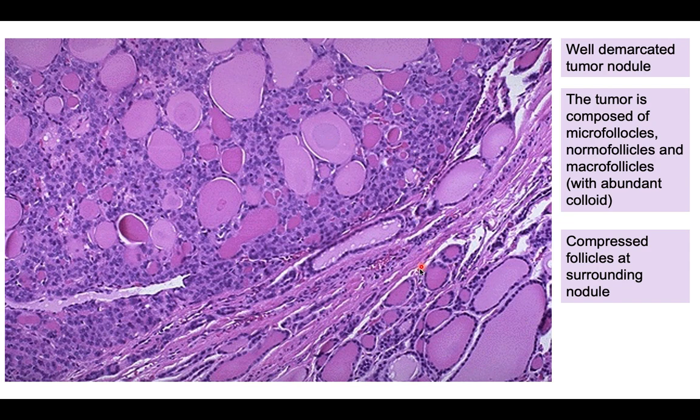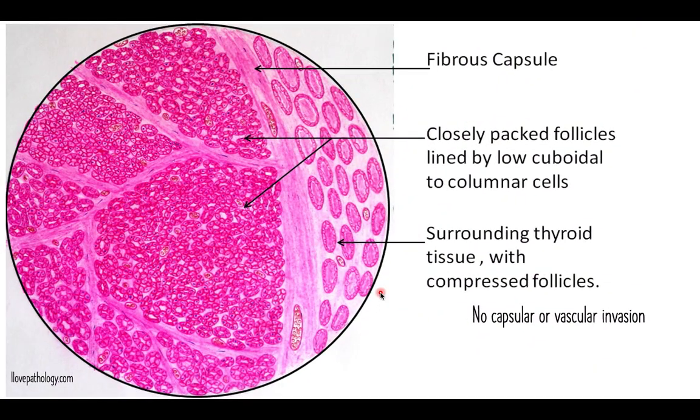And the follicles surrounding the nodule are being compressed, and there is no capsular or vascular invasion.